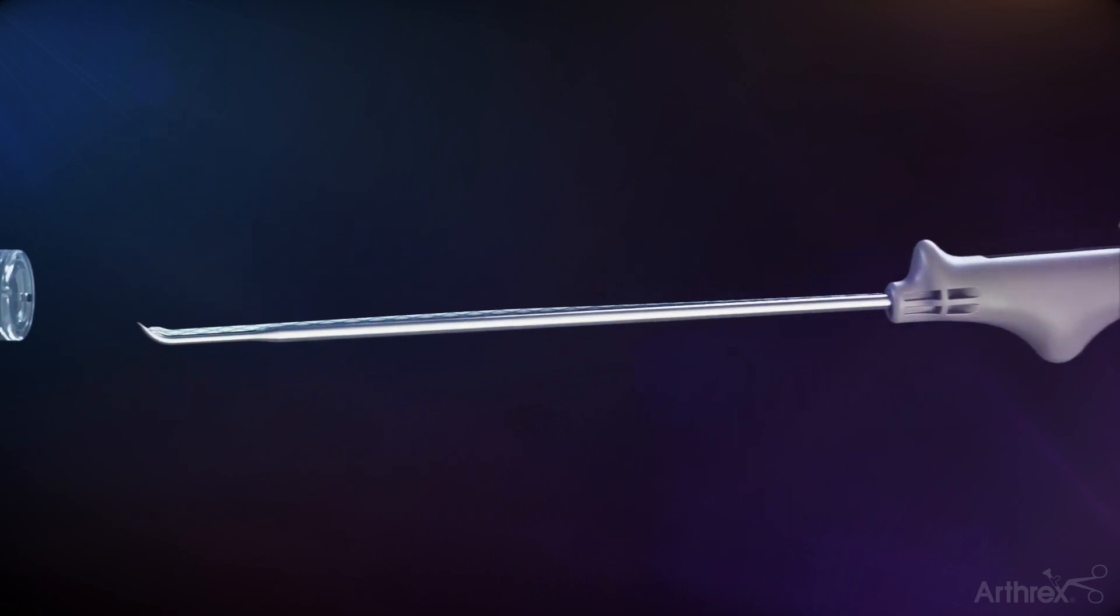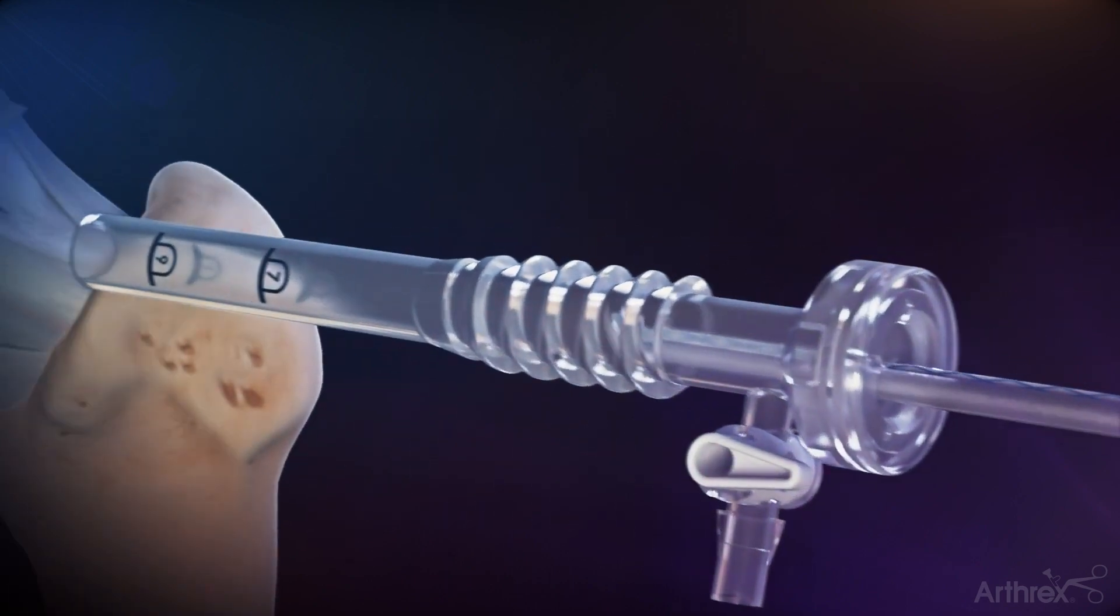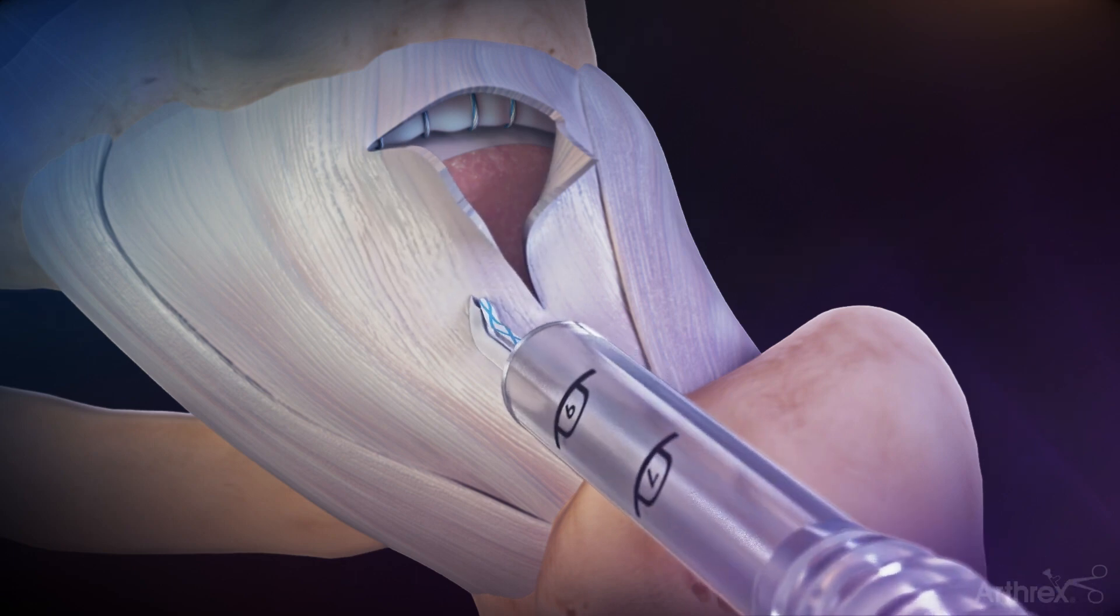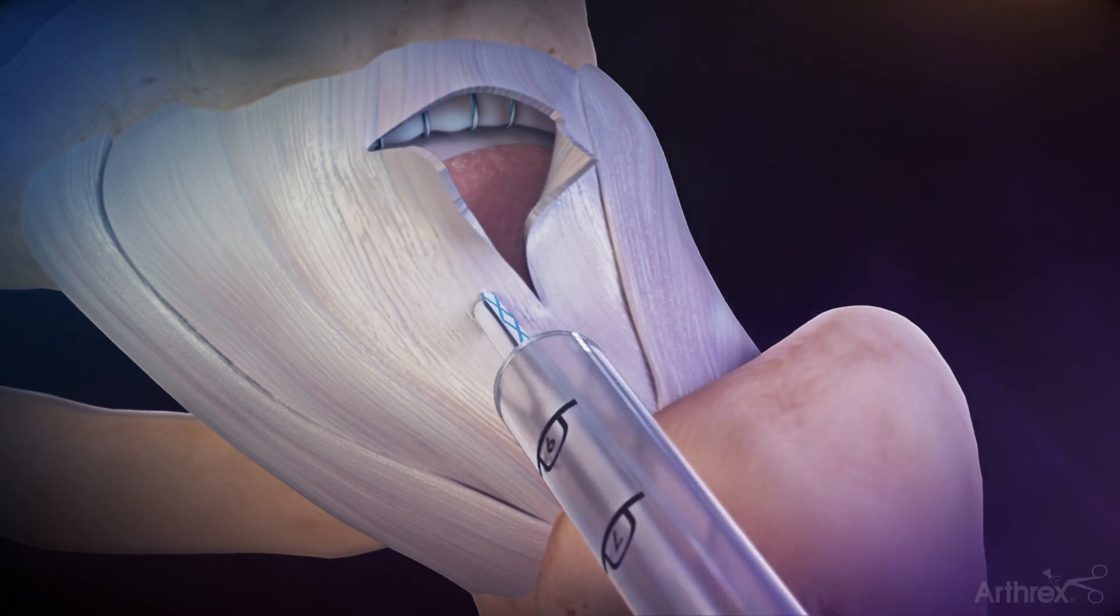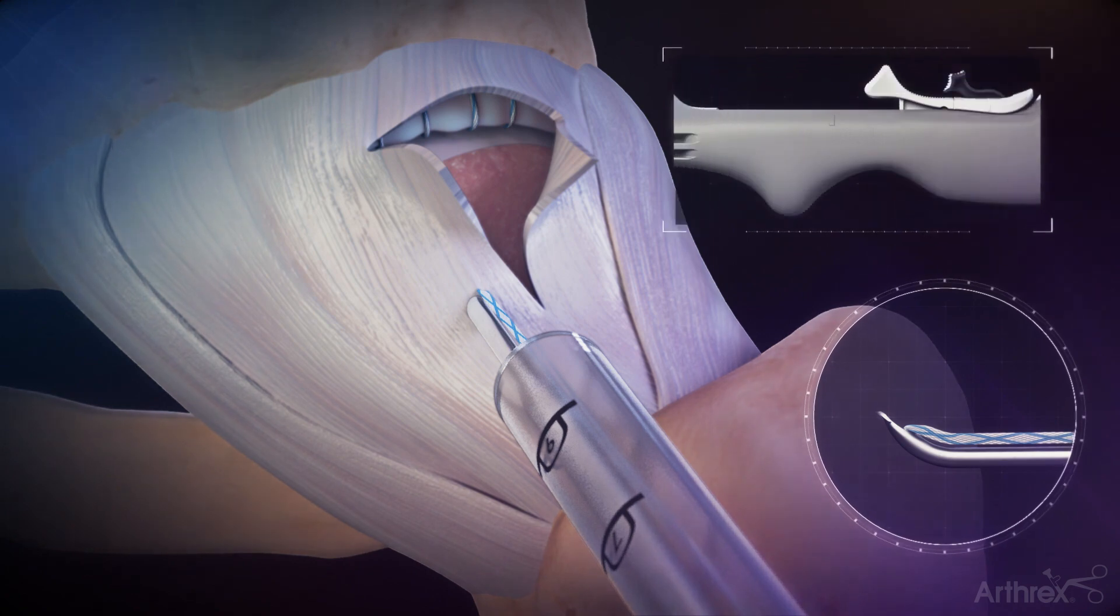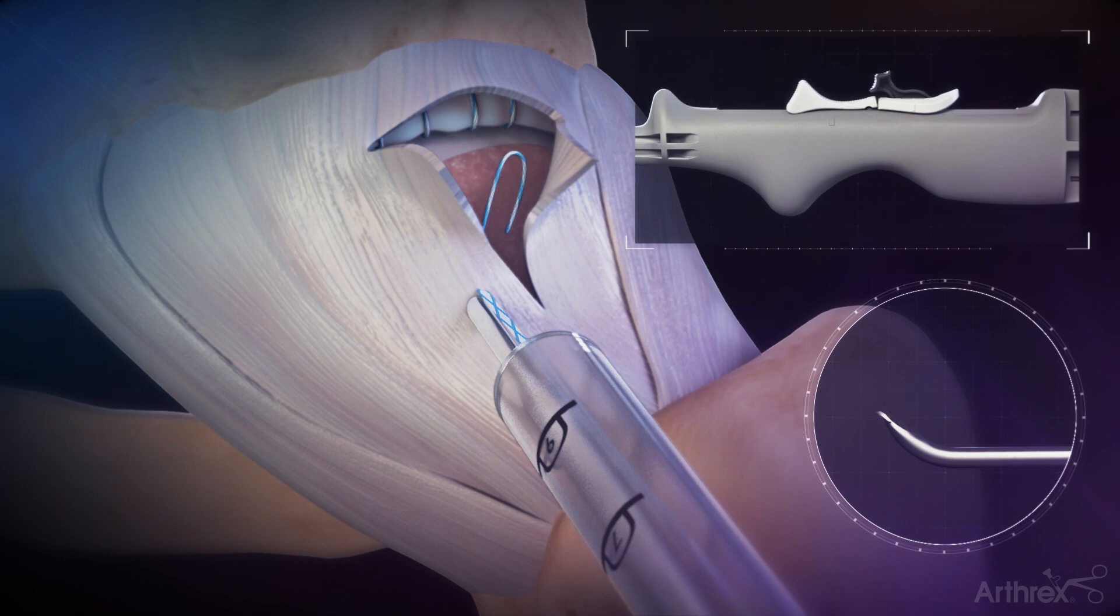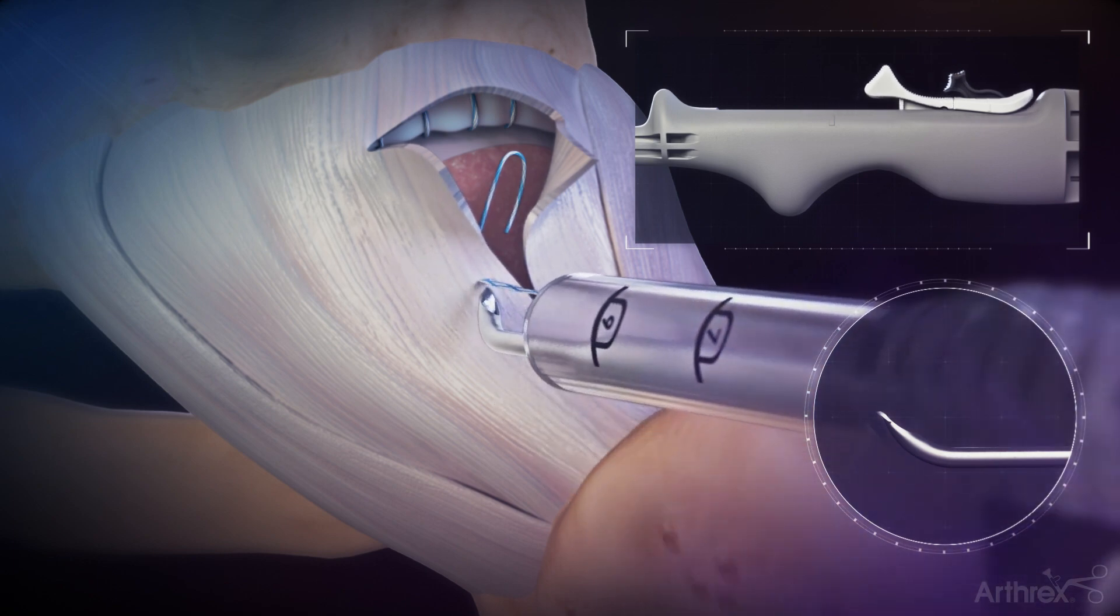Place the capsule stitch suture passer through the distal anterior lateral accessory portal to pass suture through the most distal medial aspect of the T capsulotomy. Push the suture underneath the capsule and into the peripheral space by pushing the white sliding actuator down and forward. Once the suture is released from the jaws, push down and pull the white sliding actuator backward so it's loaded back into the needle.